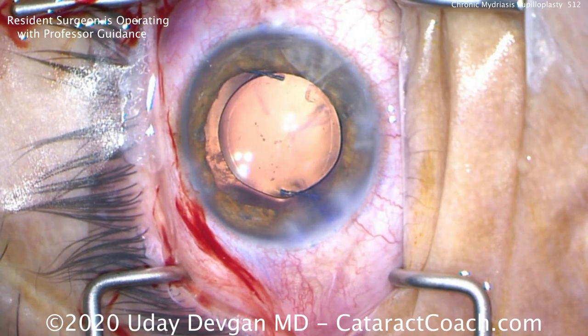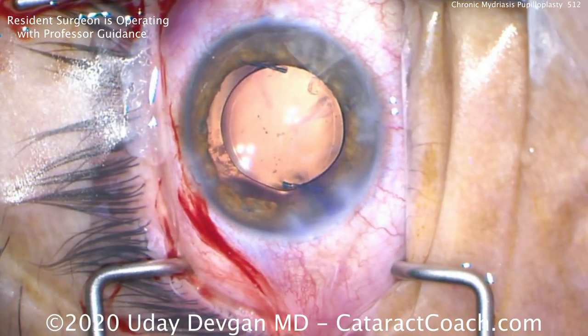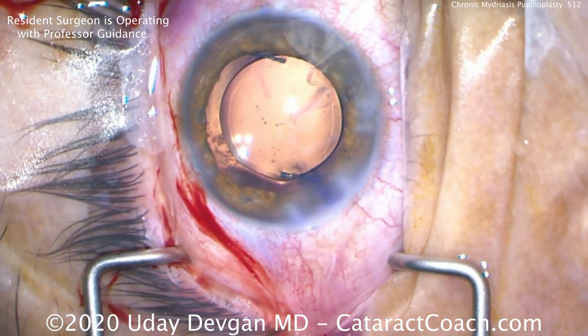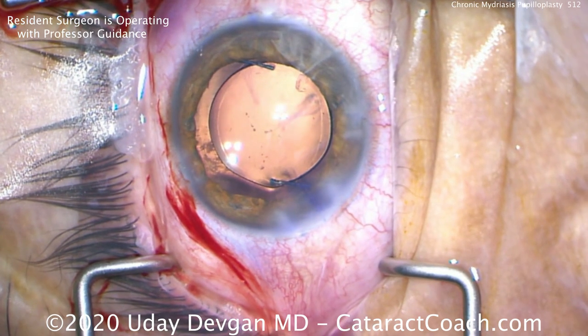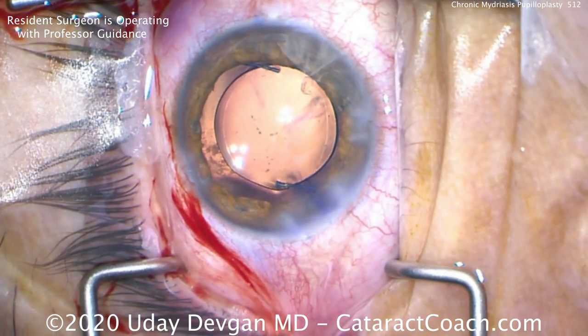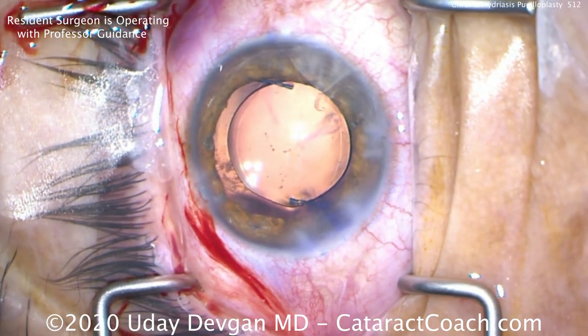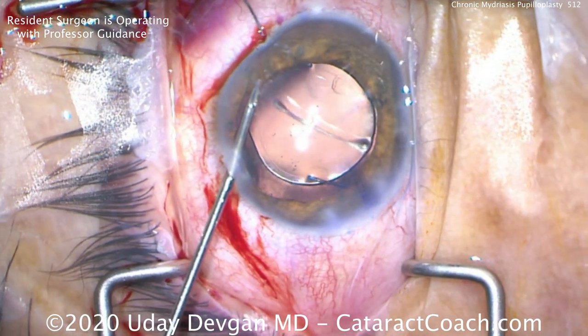Part 1 was the cataract surgery, in which we had 3 or 4 clock hours of zonular loss, maybe even more. We put a capsule tension ring in, were very careful, and avoided vitreous prolapse. We have a 3-piece lens with the haptics in the sulcus, 90 degrees away from the area of zonular loss, and the optic is captured like a button through a buttonhole behind the capsulorhexis.